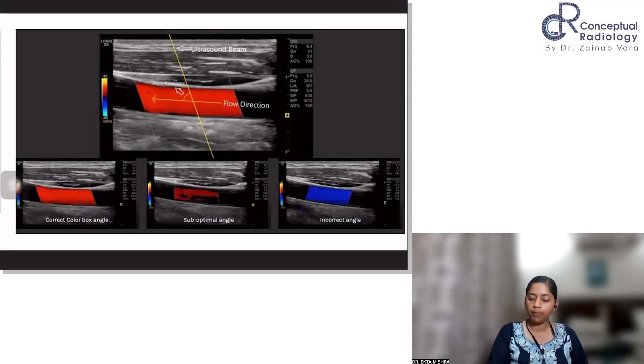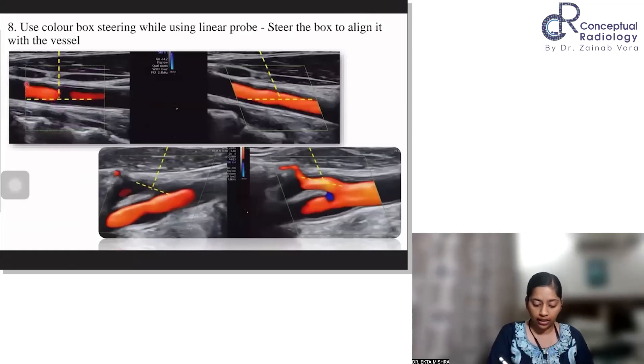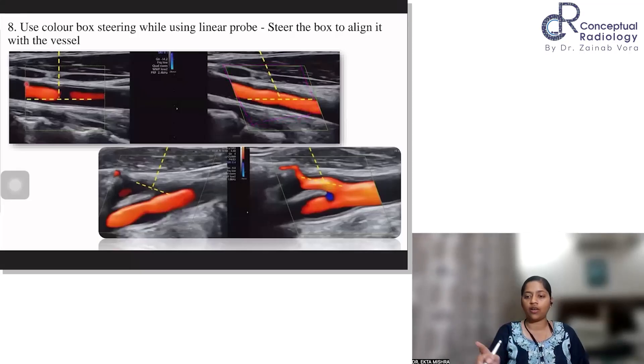So to avoid this patchy appearance, steer your box. So how does the steering help? See, this is a straight box and the angle of insonation is 90 degrees. So we are not seeing flow here. Is this flow which is not appreciated here because of a pathology? No, it's not because of a pathology. It's because of the mechanical or the technical factors. So if you angulate your box and now it forms a parallelogram, you see how nicely the vessel is filled completely now. So this is what we want.